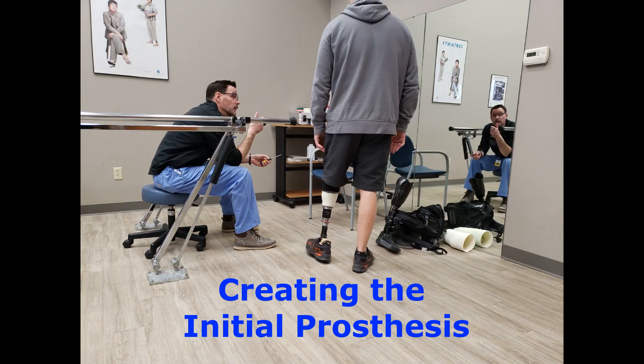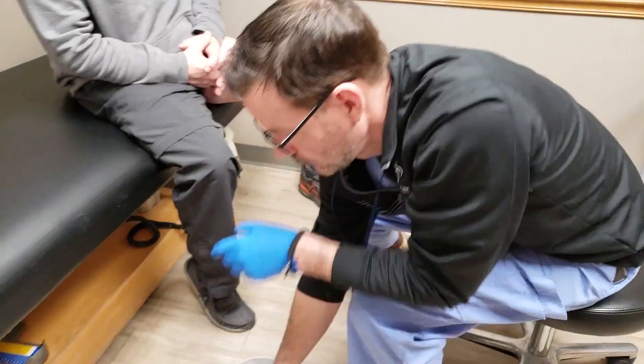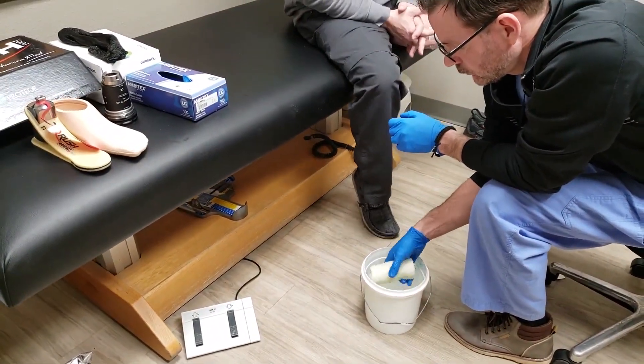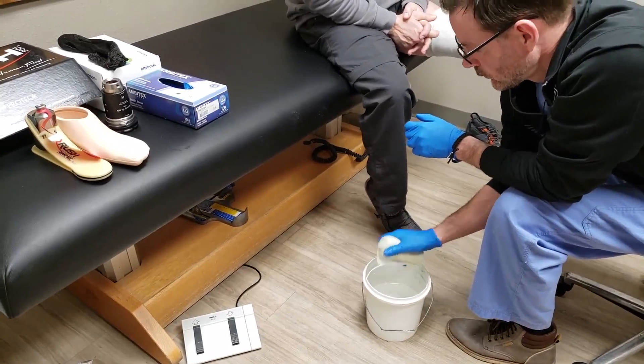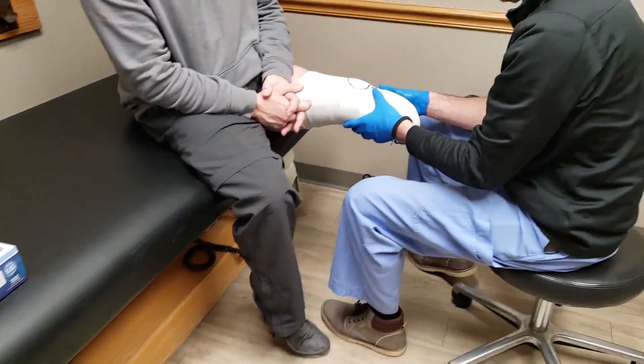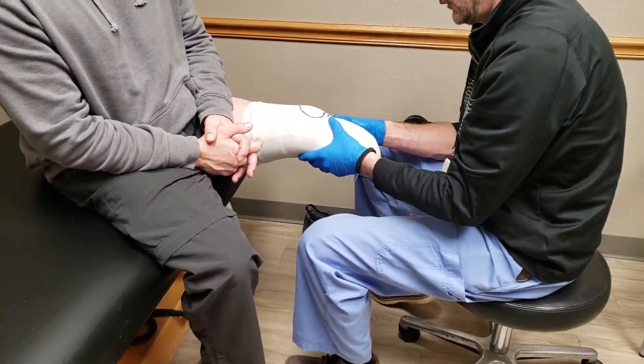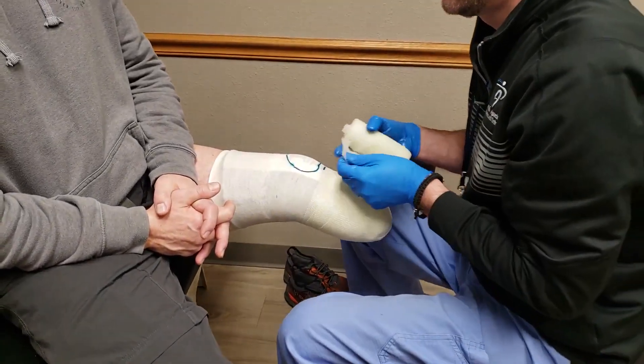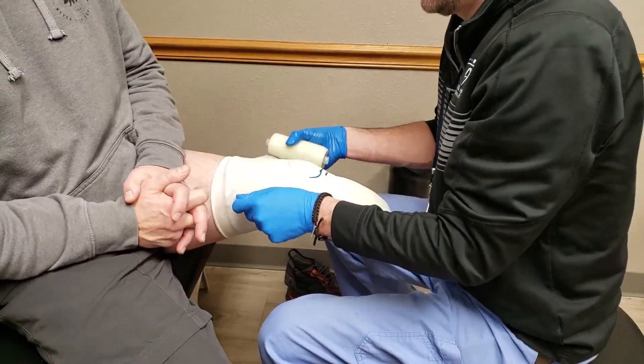Welcome to Clark and Associates' video tutorial taking a behind-the-scenes look at how a prosthesis is made. The first step in fabricating a prosthesis is acquiring a mold of the human body part we are interfacing with. In this case, we are fabricating a lower extremity, or transtibial, prosthetic device.